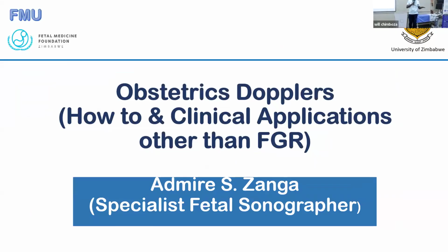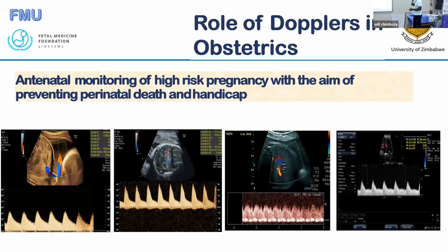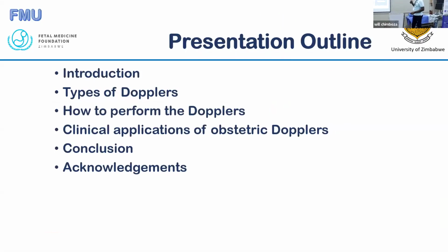It's like the foundation of most of the presentations which have been done, some which will be done. So I'll just be explaining a few things there. All right. So that's my presentation outline, which encompasses the types of Dopplers available, how to perform the Dopplers, clinical applications of obstetric Dopplers.